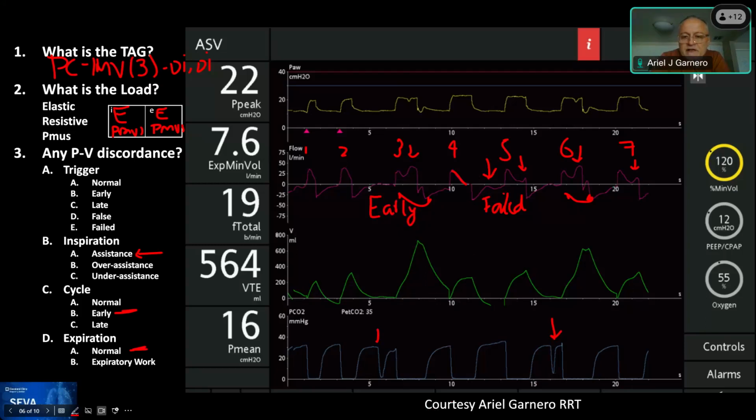I would try, I mean, if in any mode, I would switch to pressure support. But ASV, since it's a form of IMV type 3, you can reduce the percentage of assistance from 120 and try to make it lower, and just to see if the patient is picking up more, and you remove the mandatory rate. Okay, right. So the rate, exactly.